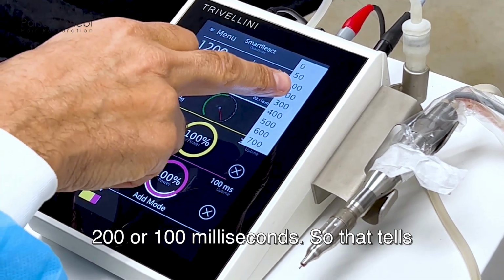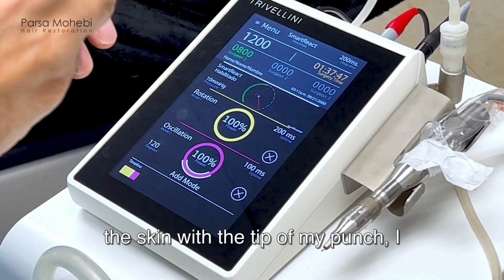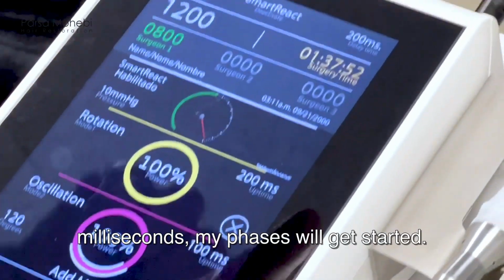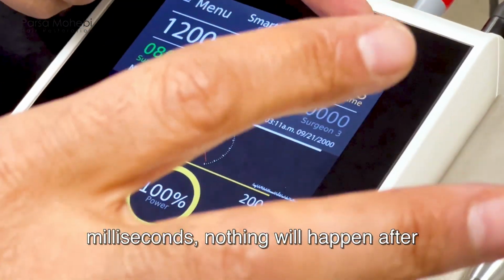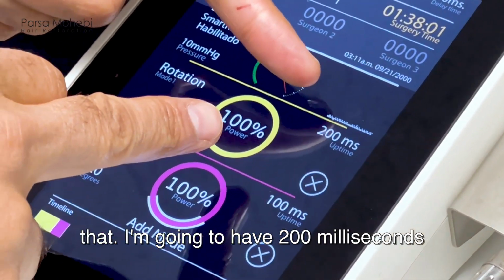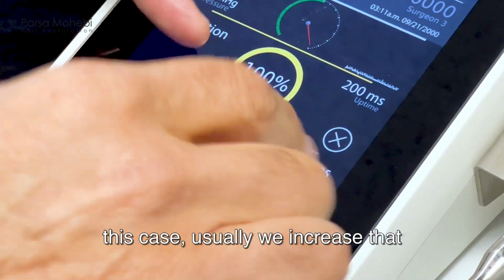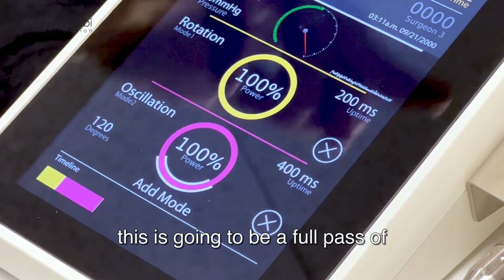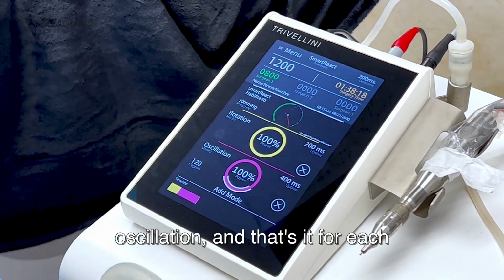I usually put it on 200 or 100 milliseconds. So that tells the machine that every time I touch the skin with the tip of my punch, I have 200 milliseconds to adjust my punch, center it, and then after 200 milliseconds, my phases will get started. So I touch the skin, I wait 200 milliseconds, nothing will happen. After that, I'm going to have 200 milliseconds of maximum energy rotation, followed by 100 milliseconds of oscillation in this case. Usually we increase that number to probably 400 or 500. So this is going to be a full pass of delay, rotation, oscillation, and that's it for each graft, and it's going to be repeated exactly the same for every set of extractions.